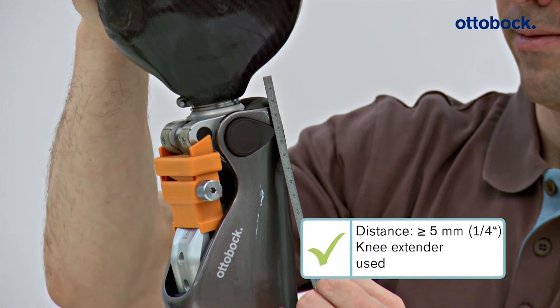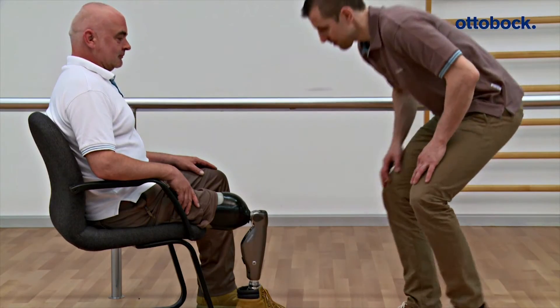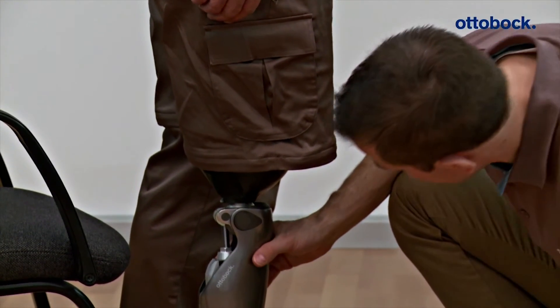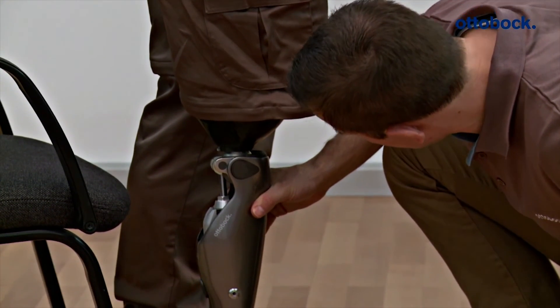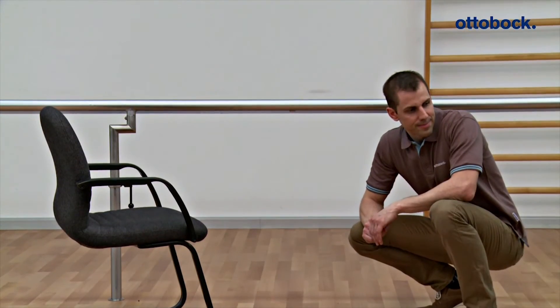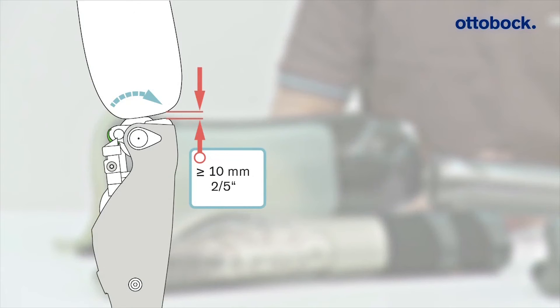This is the case here. Finally, the constructed prosthesis is checked once more on the user for sufficient distance under a load in a static situation. If a C-Leg 4 protective cover needs to be installed later, the required safe distance between the prosthetic socket and main electronics increases from five millimeters to ten millimeters.